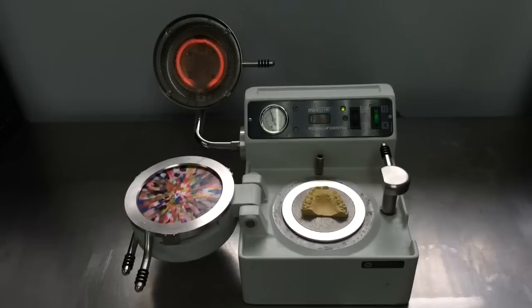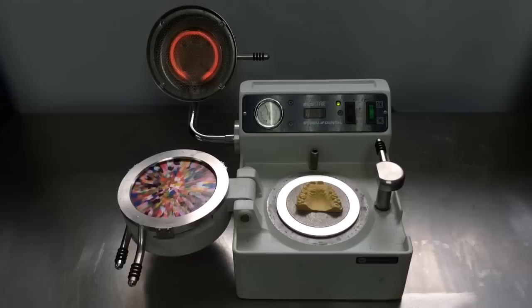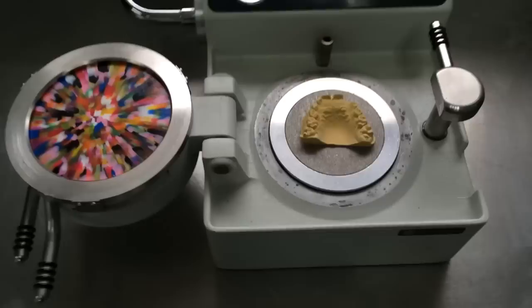All right, so here is how the mouth guard itself is actually made. This is the little machine, it's called a mini star. This is the machine that actually makes the mouth guard. So we've got the model here. Over on this side here, here's the actual mouth guard material.